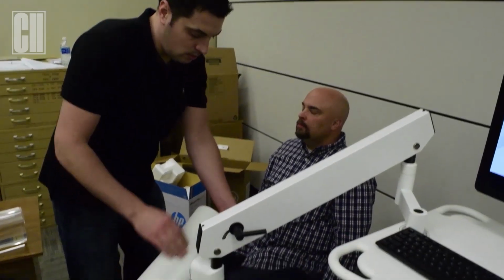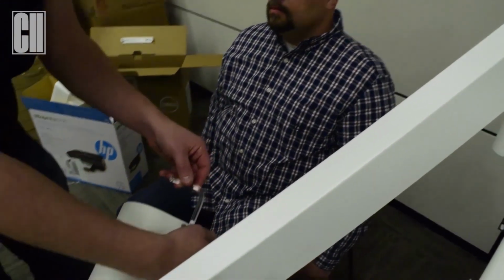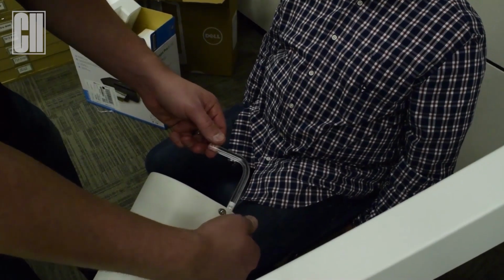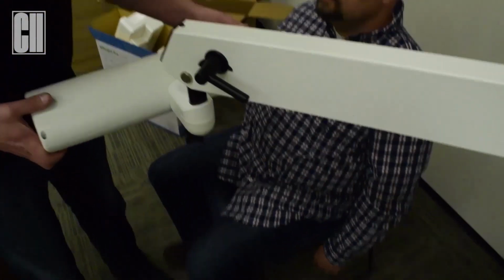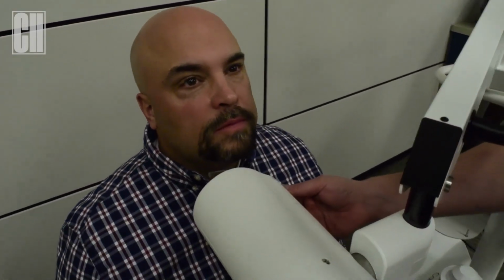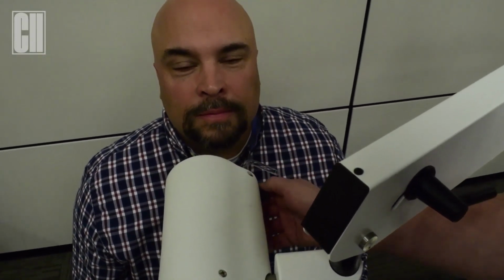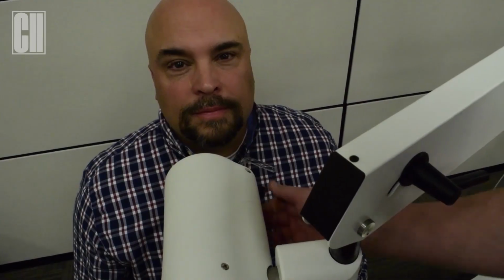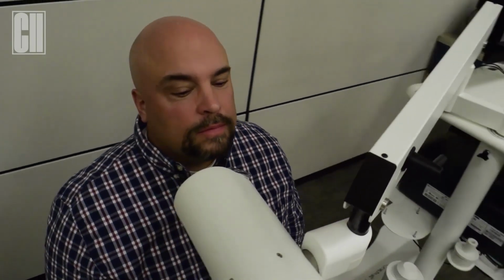Once again, you want to line up the pointer rod so it's in the center. You should feel a little click indicating that it's centered to line up to our patient's neck. Once you have that lined up to your patient's neck, loosen that screw again, move it out of the way so there's no attenuation again, and then we can perform the count.